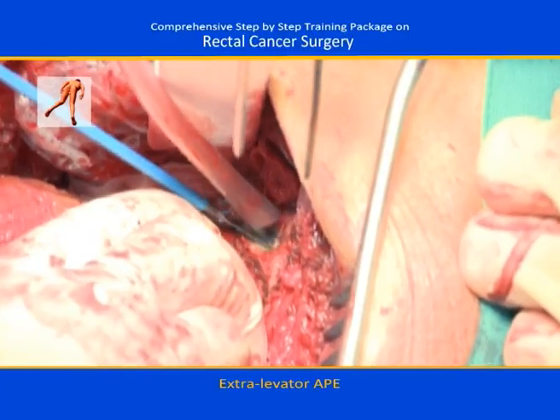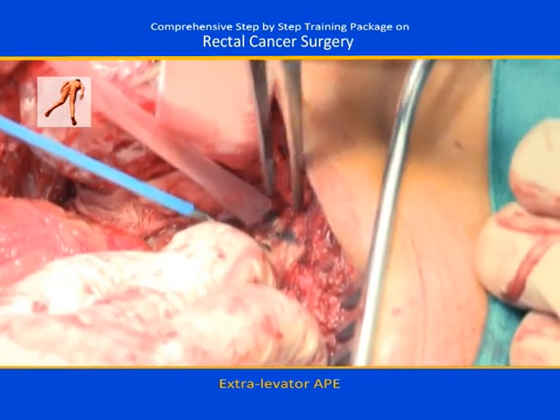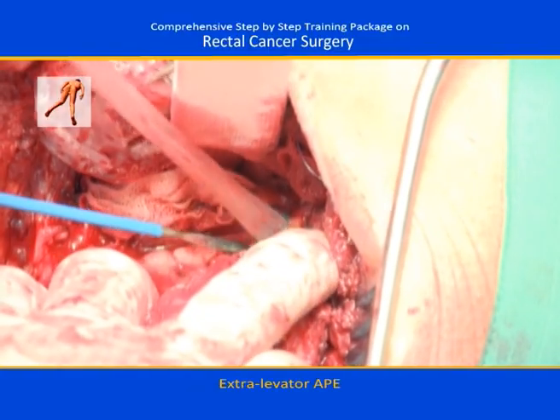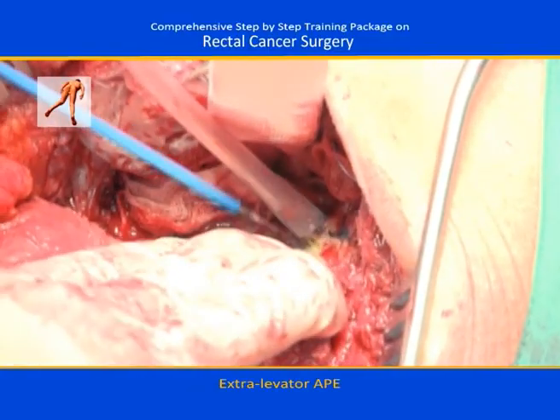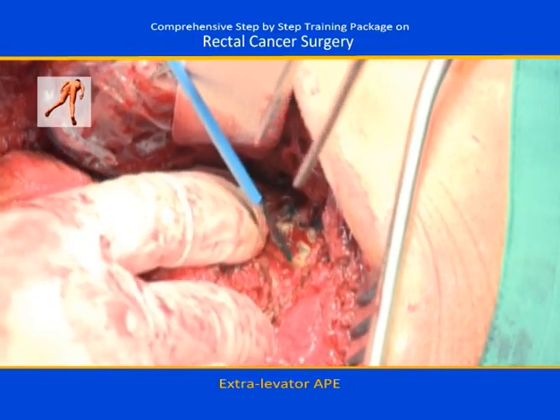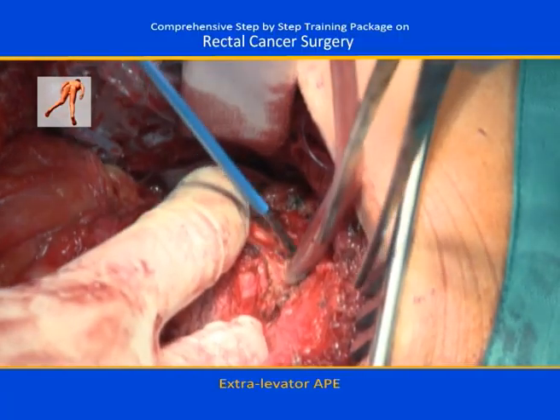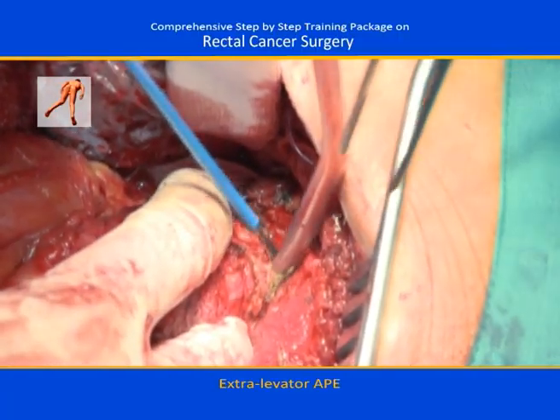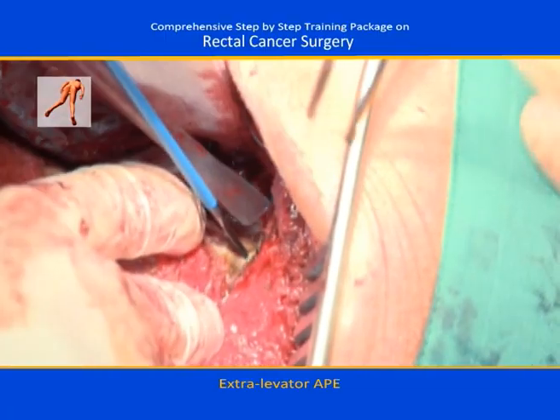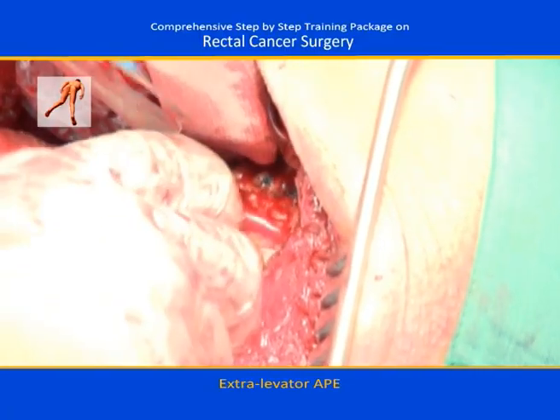On the patient's right side, the tumor is close, and therefore we have to sacrifice the neurovascular bundle on the right side. And you can see here that we divide the bundle with diathermy to be absolutely sure not to come too close to the tumor. This is, of course, a procedure where you may have bleedings from the neurovascular bundles, and you have to stop those.